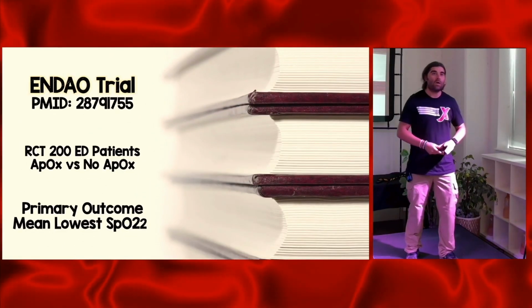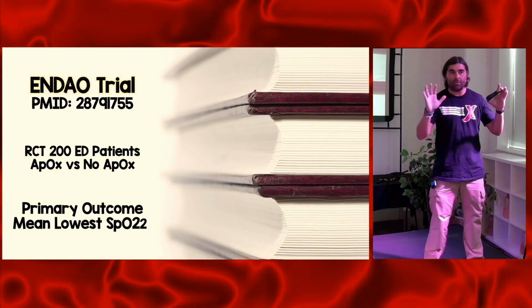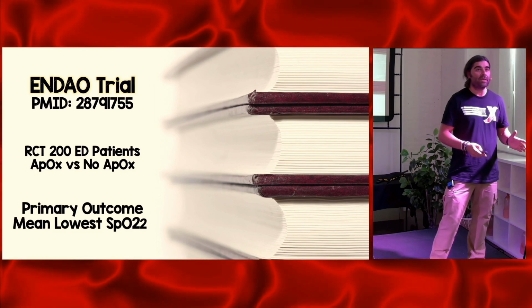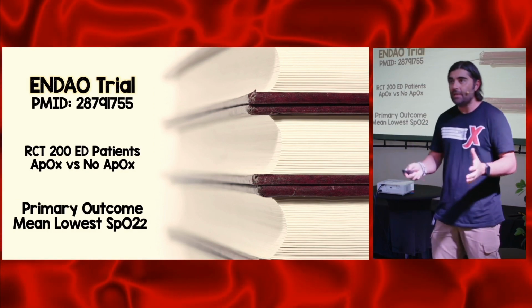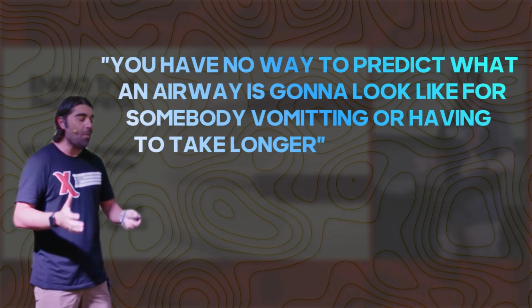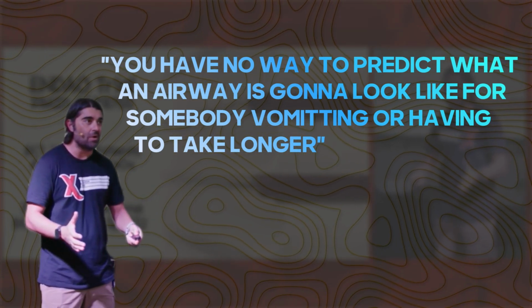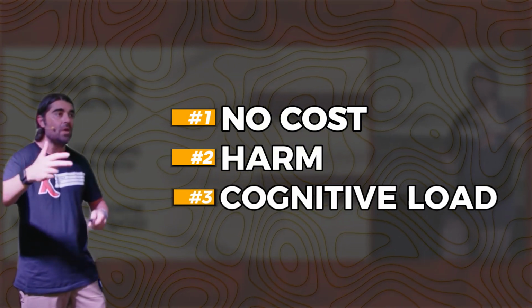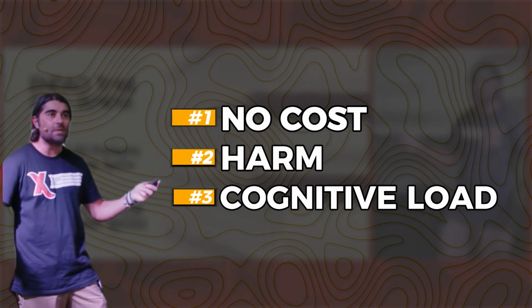Now, for those who are or aren't using apneic oxygenation, what I will tell you, and I'll be very upfront about this, is I think if you do a really good job with pre-oxygenation, apneic oxygenation is probably superfluous. But you have no way to predict what an airway is going to look like, or somebody vomiting or having to take longer. And so to me, it's no cost, no harm, no cognitive load. Just slap the nasal cannula on them and stop quibbling about whether it works or it doesn't work.